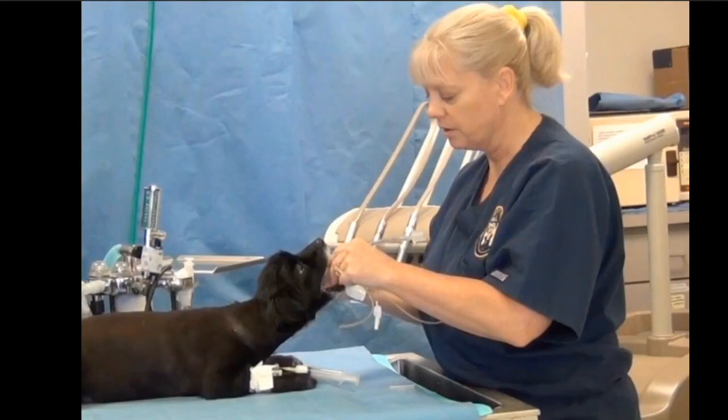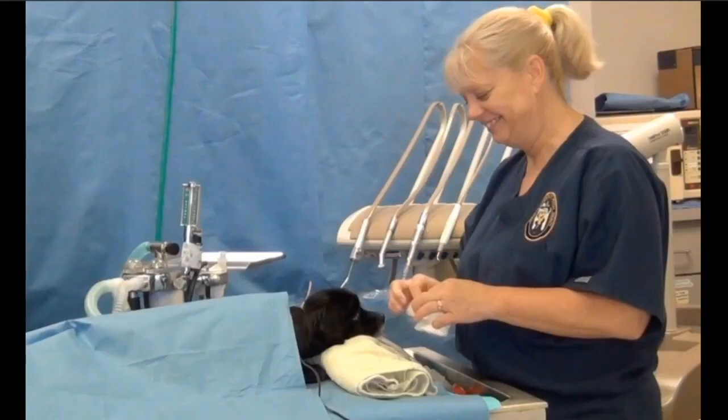So when we're intubating the patient, we induce the patient and they're in sternal recumbency. What we're going to do in a case like this is go ahead and just put a little towel underneath the patient so that the palate is parallel to the table. That removes a lot of variables.